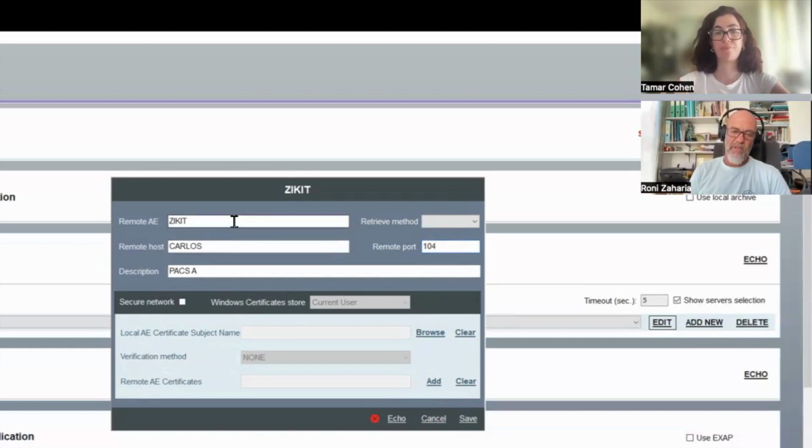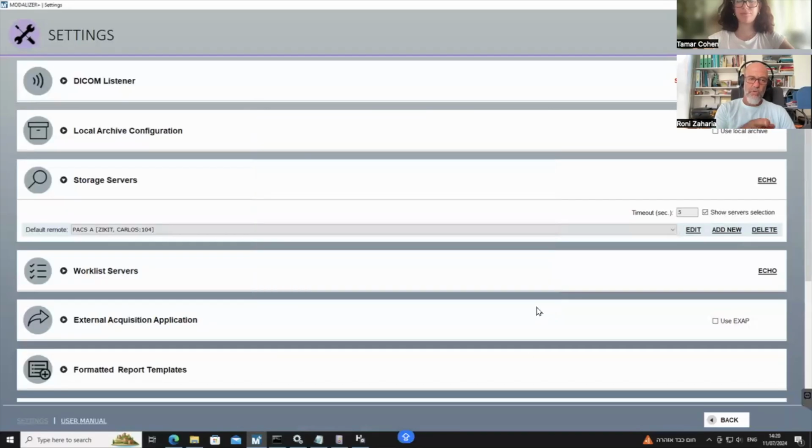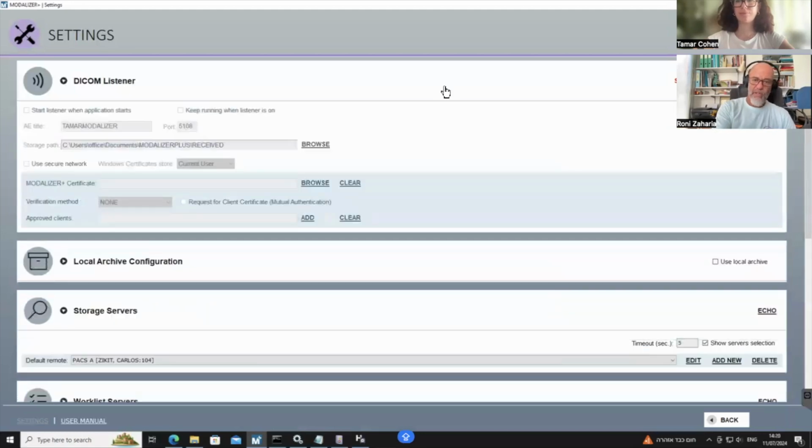Another common error is when you don't get the AE titles correctly. If you remember, I said that the host and the port are on the network level, while the AE titles are something unique to the DICOM protocol. So if, for example, the AE title of the PACS is different from Zikit, or your AE title is different, let's click Save here and go to the DICOM listener section. Here you can stop the listener, and here we configure the AE title of your workstation. This is the identification of your Modalizer Plus.